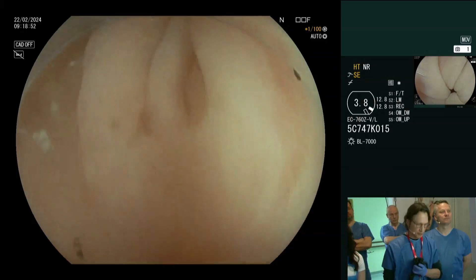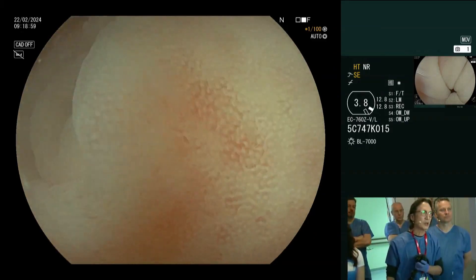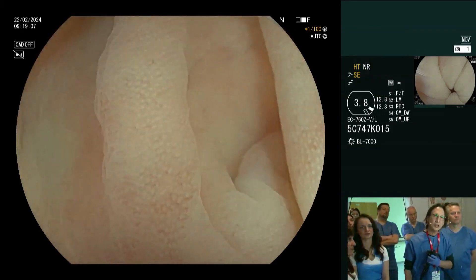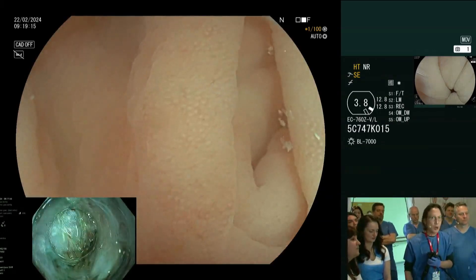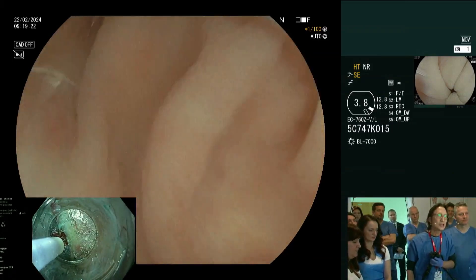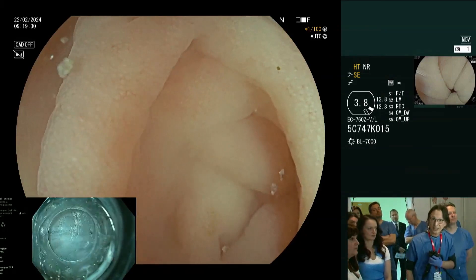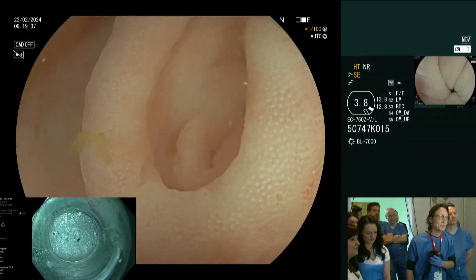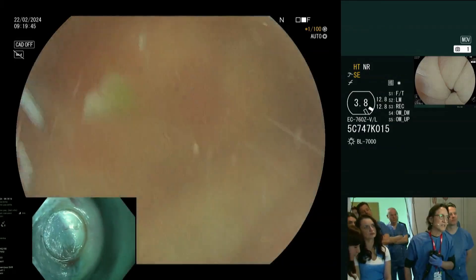Let's turn the near focus on so you can see how the optical zoom works — you can see how the pit pattern is so much better now. I always take a moment to look at the appendiceal orifice. I want to demonstrate how you use water to interrogate the mucosa — it's an additional tool you don't have with gas. You cannot interrogate with gas, but you can with water. I can fill the appendiceal orifice, and I not uncommonly discover sessile serrated adenomas involving it. But this appendiceal orifice looks completely normal.